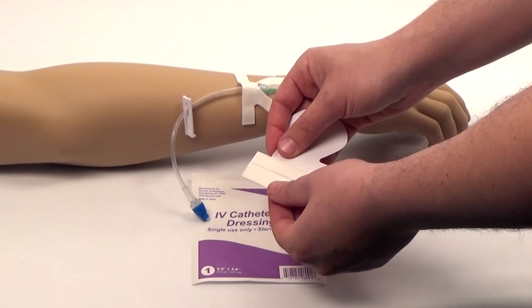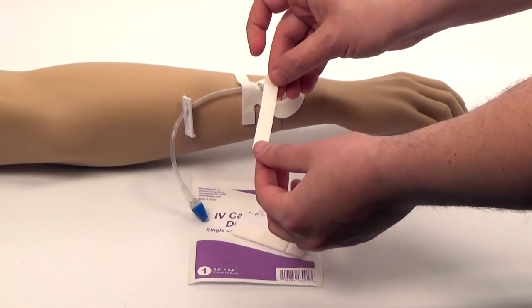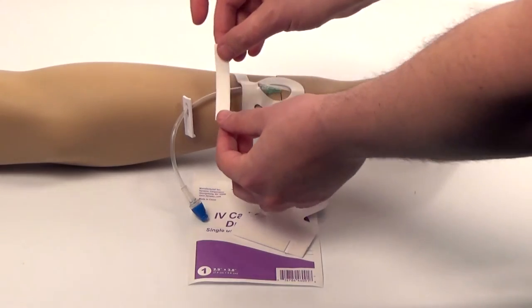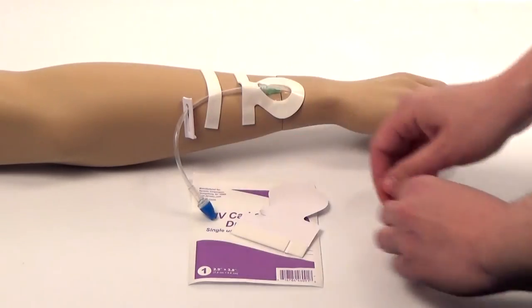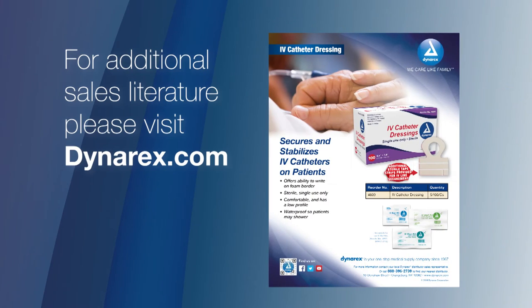The IV catheter dressing also includes an additional piece of foam. This foam can be used to further secure the IV extension set. For many more Dynarex products, please visit Dynarex.com. Thank you.